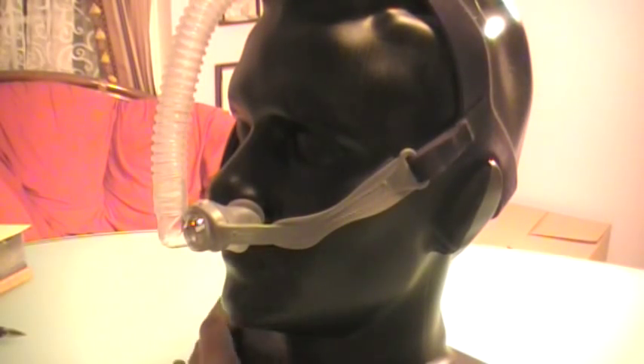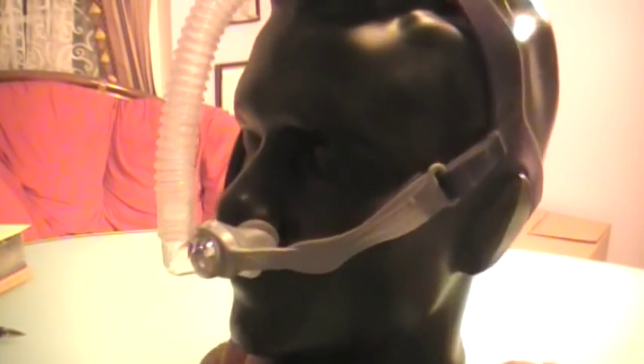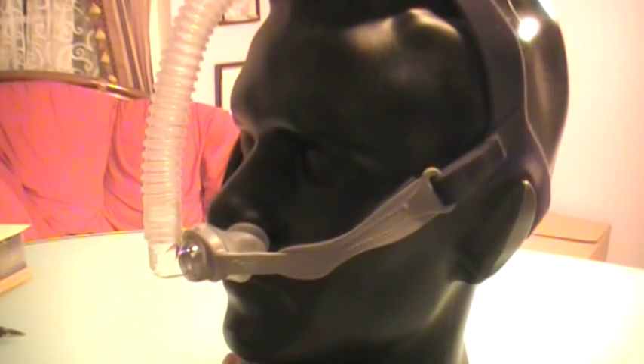Welcome back to cpaphelpdesk.com. This is a video review of a nasal pillow system called the Opus 360, made by Fisher & Paykel.